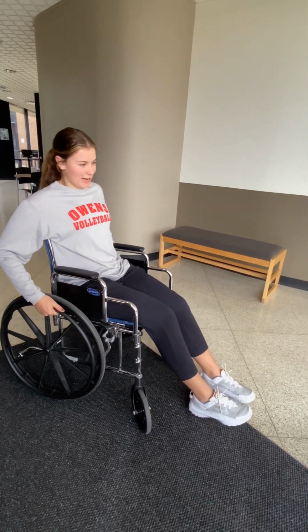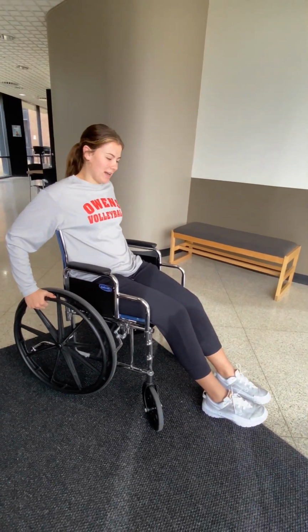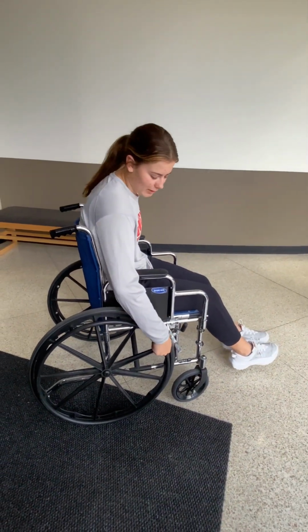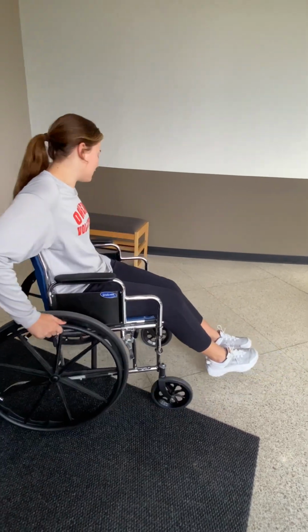Okay, so we're going to learn the basic mobility of using a wheelchair. First, we're going to do upper extremity propulsion. So to go forward, you put your hands on the rims, not the tires, and go clockwise. To go backwards, put your hands on the rims and go counterclockwise.